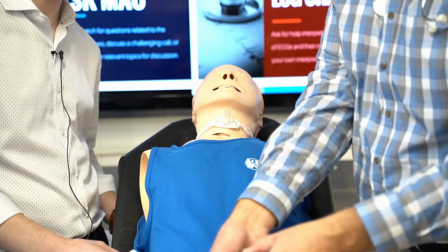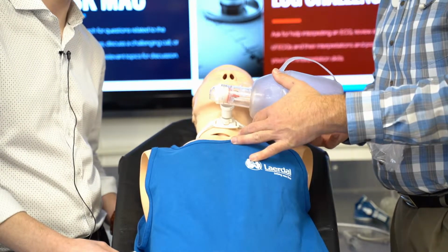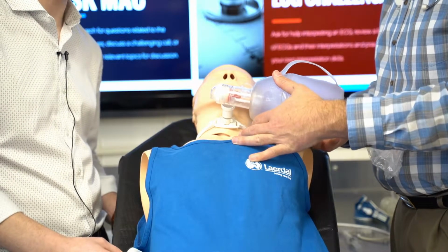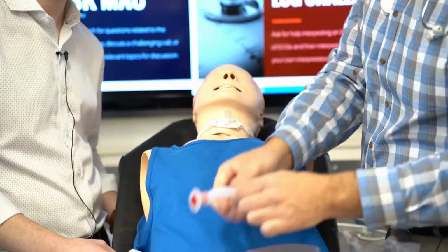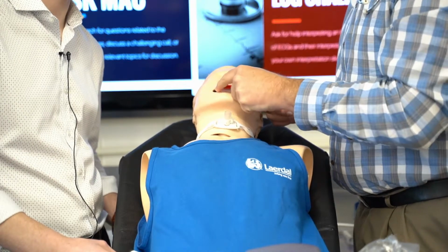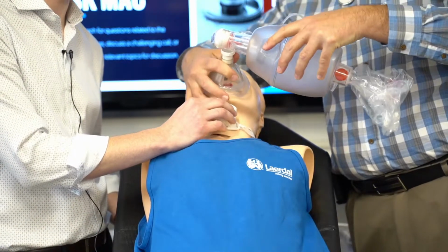Now with this patient, we're going to go ahead and try to ventilate, but we're going to play this out a little bit. We're going to say that the respiratory effort and ventilations we are providing are not adequate. So we're going to try a different method via the oropharynx. With this method, we're now going to put in an OPA, perfect. We're going to go ahead and cover the stoma and try to generate some positive pressure during ventilations.